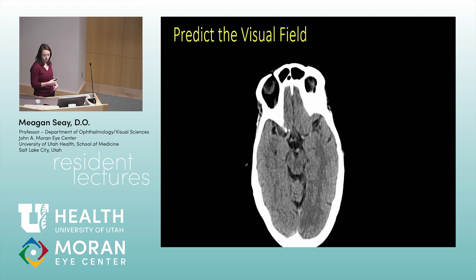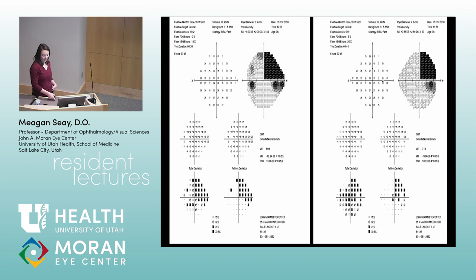Roughly, where are we? Occipital lobe. It's hard to tell on this. Let's say it's the inferior occipital lobe. What is the visual field defect with that? Superior. Yep. So on the right side, left occipital causes a right superior quadrantanopia. So this was her visual field defect: a right superior quadrantanopia, homonymous, from a left inferior occipital infarct.